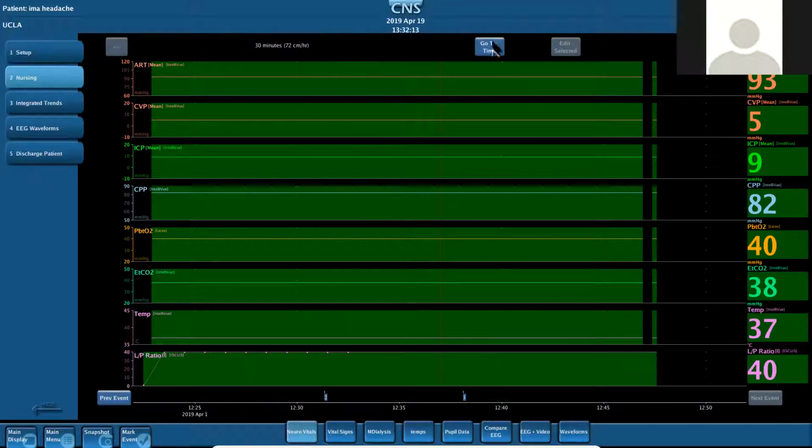But we can, again, go to a particular time, or we can go back and forth in the record and we can review this particular patient's data. So that's a nice way to be able to actually go back. What you'll notice is on an active case, this last button says stop monitoring, and then that's where you discharge the patient. If the patient is readmitted for review, you don't have the opportunity to pause it. It's just actually going to go ahead and re-discharge the patient.